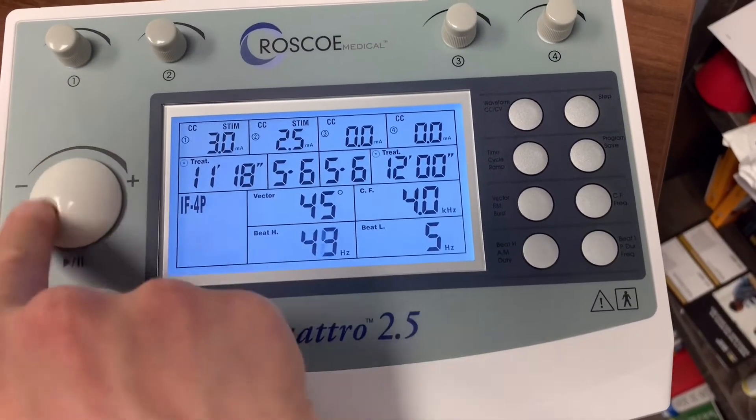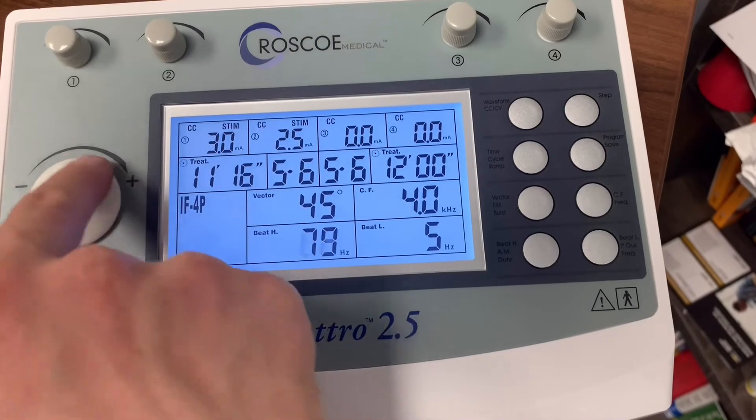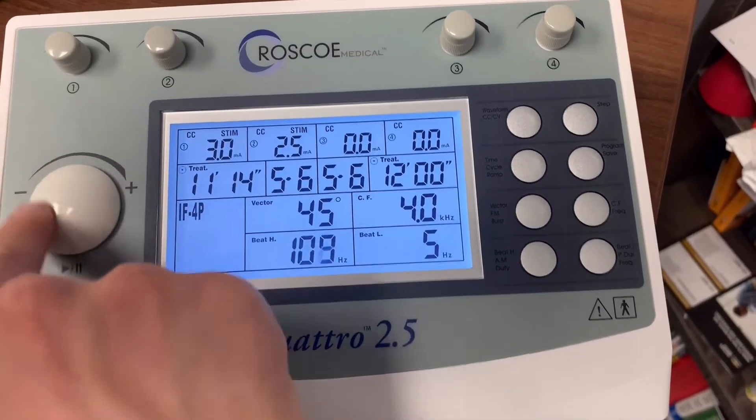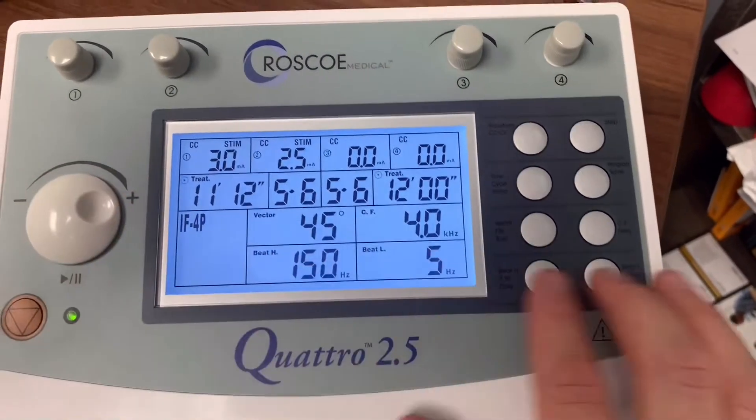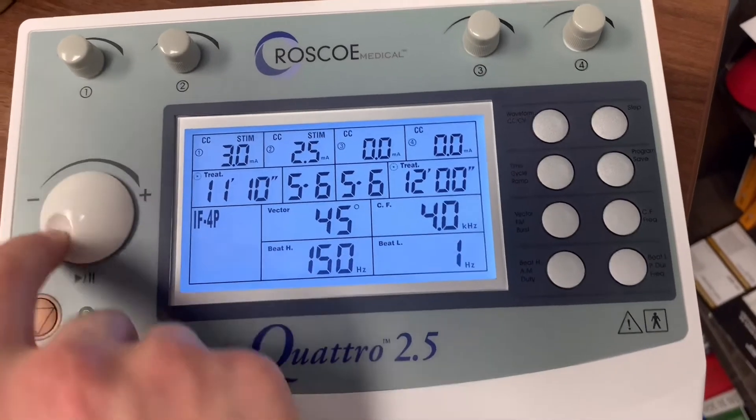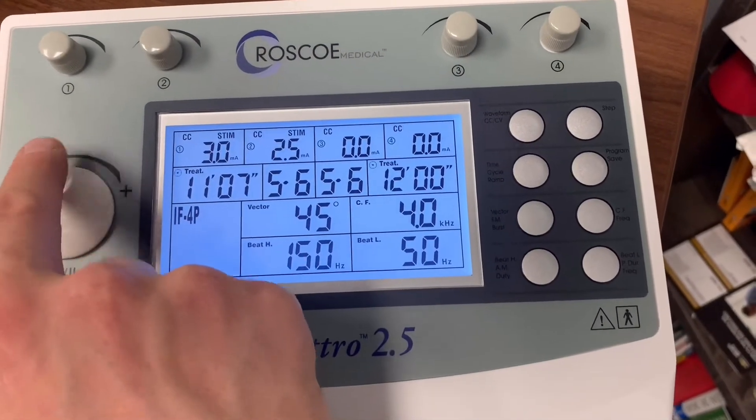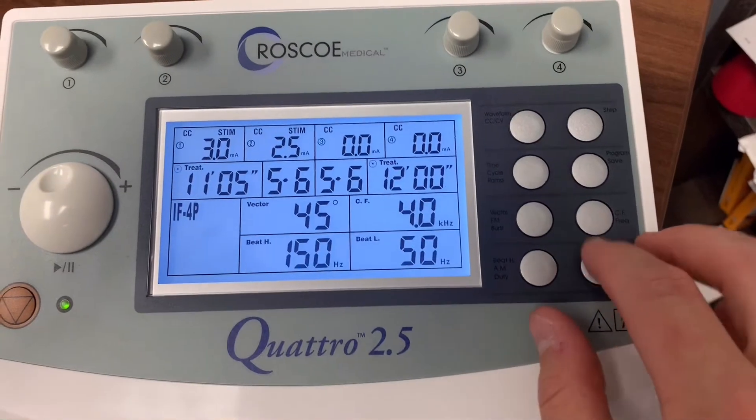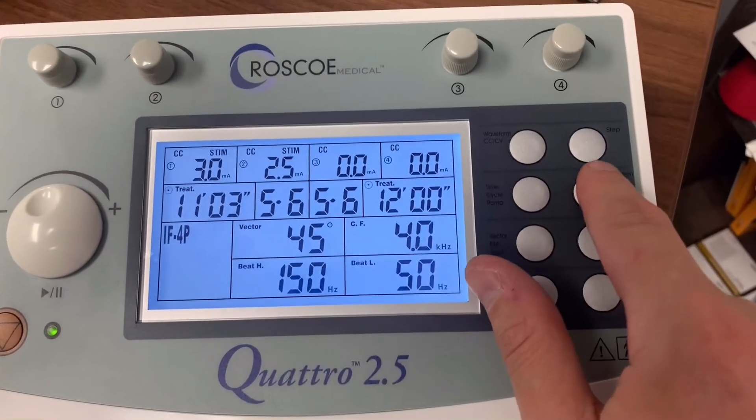we want to change that to, we had the first one was 50 to 150 below. So we've got 50, 50, okay, so we're going to save that. So 50 to 150, we're going to hit step.